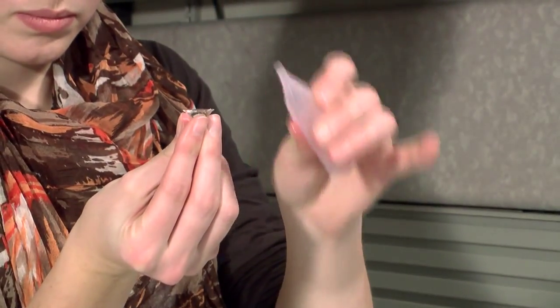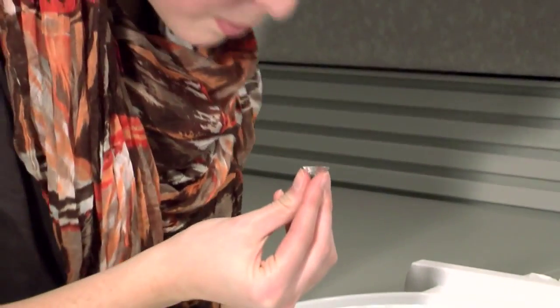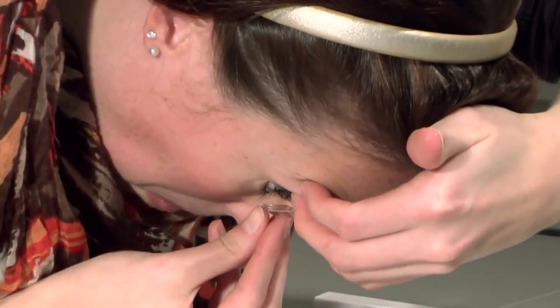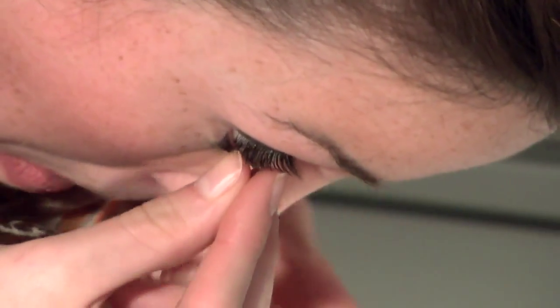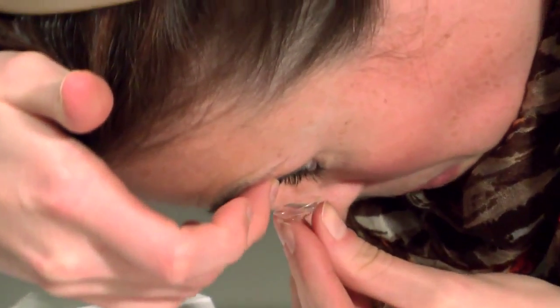To place the lens on the eye, most people prefer to use one hand to hold the eyelids open and the other hand to insert the lens. If you cannot hold both lids open wide enough to get the lens on in one move, concentrate on holding the upper lid open. Once the lens is under the upper lid, pull down on the lower lid to get the lens on the eye. Release the lids and the lens is in place. Simply repeat the process to insert the left lens.